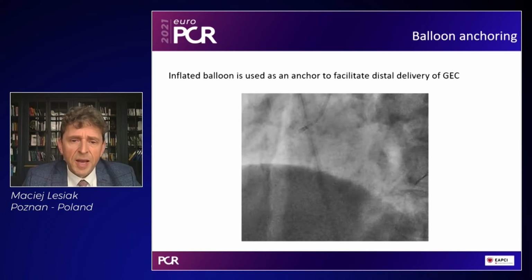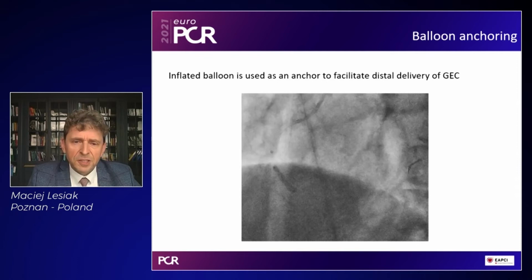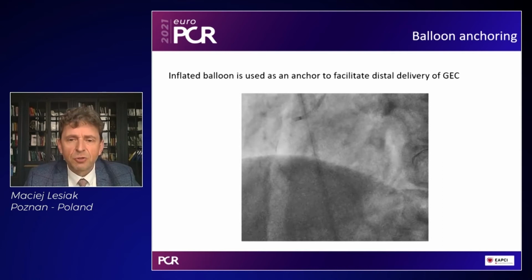With balloon anchoring, you inflate a balloon in the distal part of the vessel, and once you inflate it, you use it as an anchor to facilitate distal delivery of a guide extension catheter.